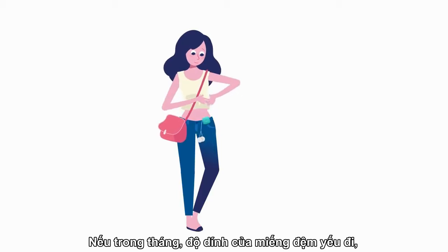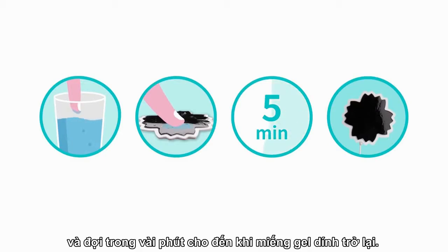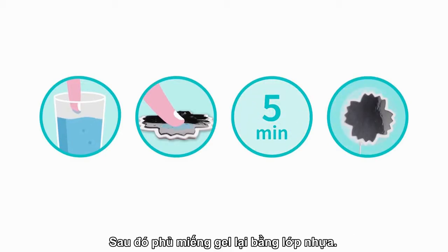Here's a little tip: if during the month the pad's stickiness weakens, you can take a tiny bit of water on your finger, soak it onto the gel pad, and wait for a few minutes till the pad is sticky again. Then cover the pad with its plastic cover.